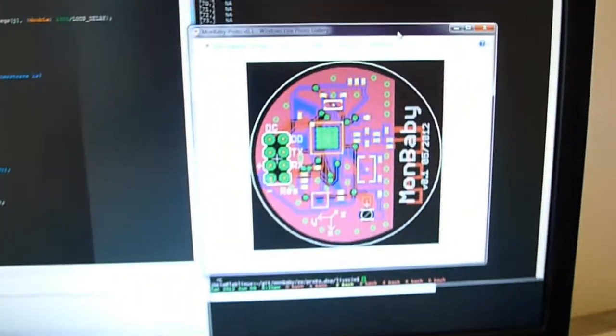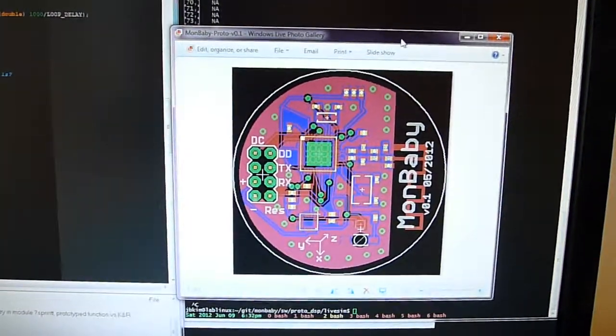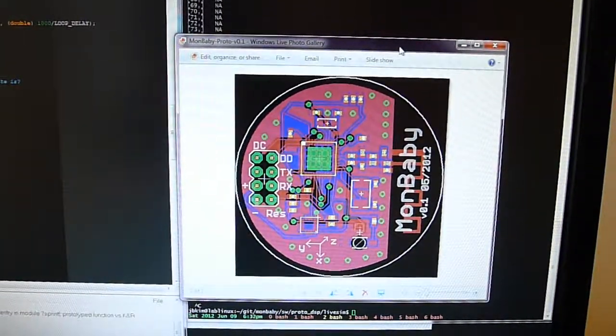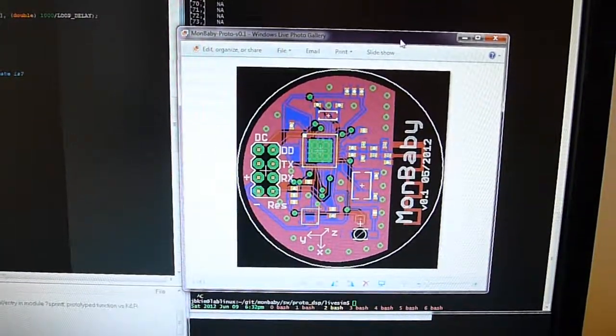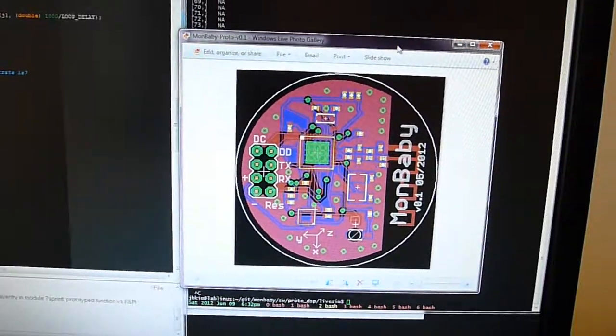Our prototype design will look something more like this, where the size of that circle is a little bigger than a coin, maybe the size of a quarter or so.